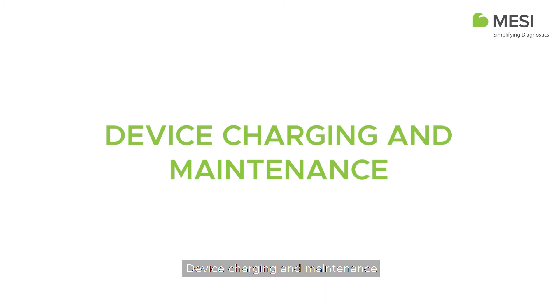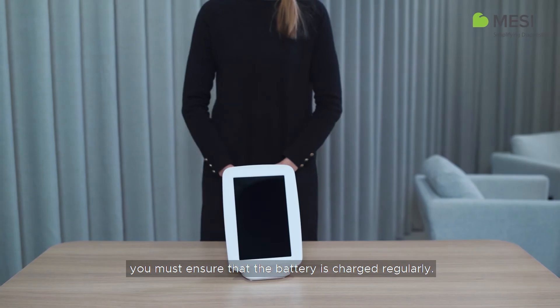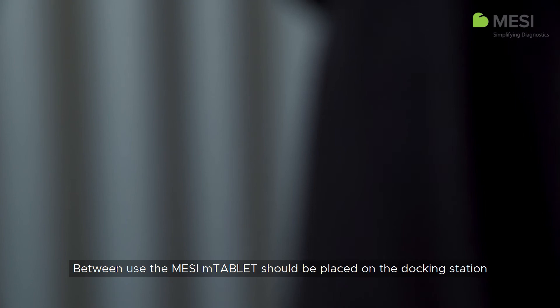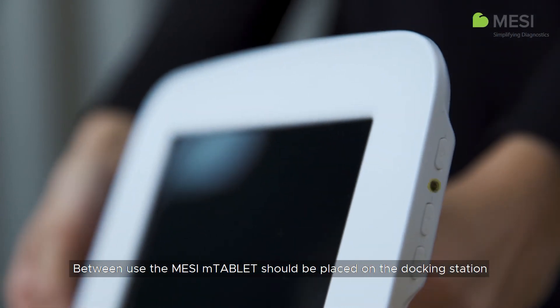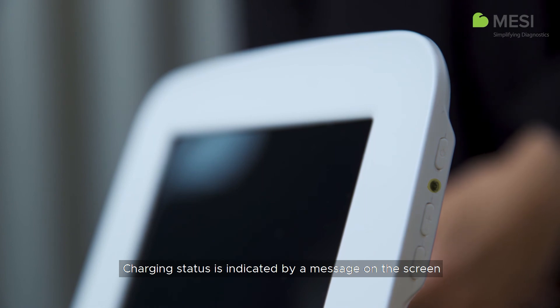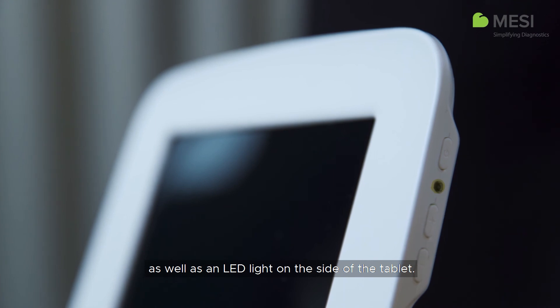Since the device is battery powered, you must ensure that the battery is charged regularly. Between use, the Macy M-Tablet should be placed on the docking station to charge its battery. Charging status is indicated by a message on the screen, as well as an LED light on the side of the tablet.